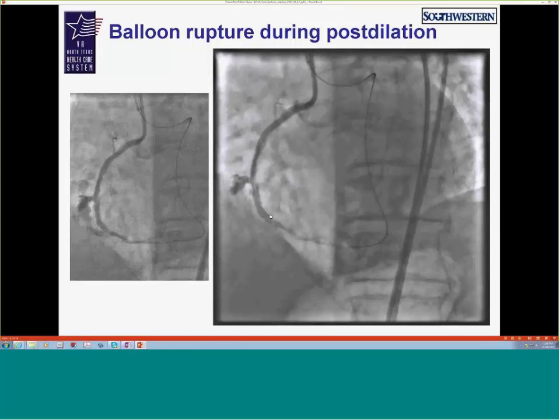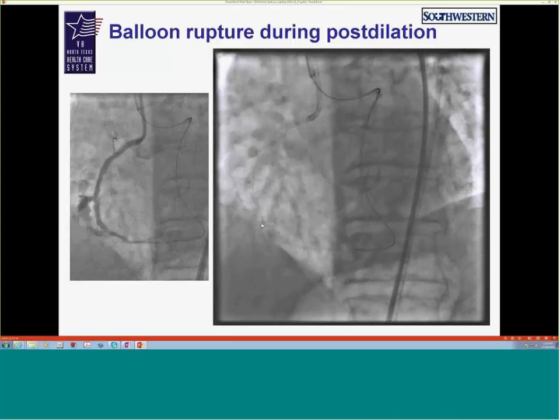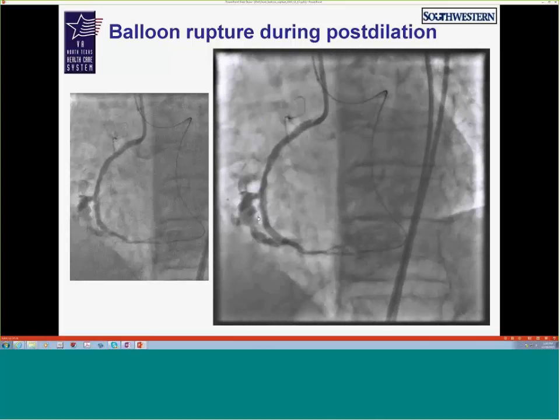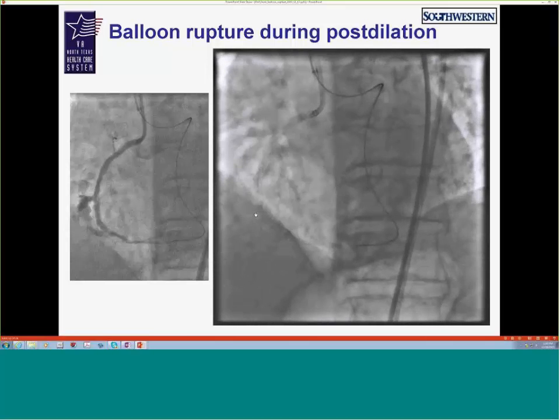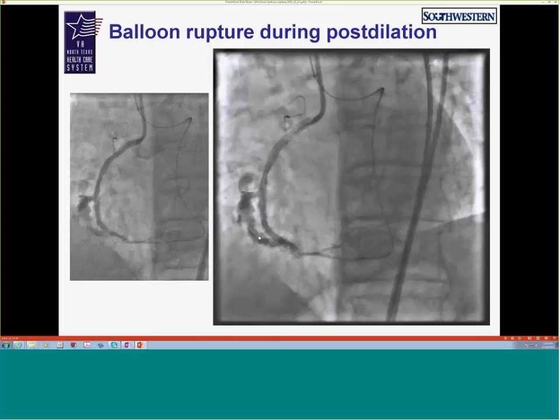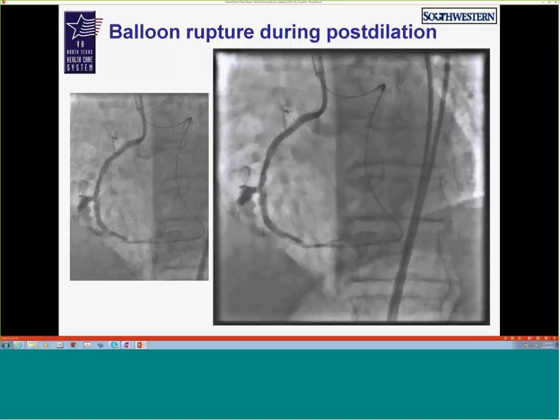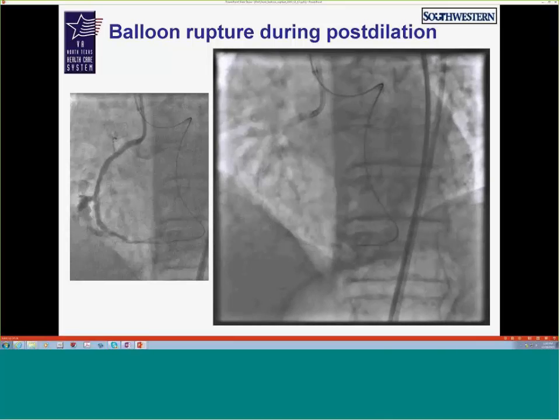I think the bummer in this case is, if you perforate when you're trying to cross or in the reverse CART, I understand this. But this one was kind of a weird one because the perforation happened because of a balloon rupture at the very, very end of the procedure. This was a very complex case, I think 3 or 4 hours in. We thought we were done. We were very excited, ready to wrap it up. The balloon ruptured and then we have this. It happened post-dilatation, but then the balloon ruptured.